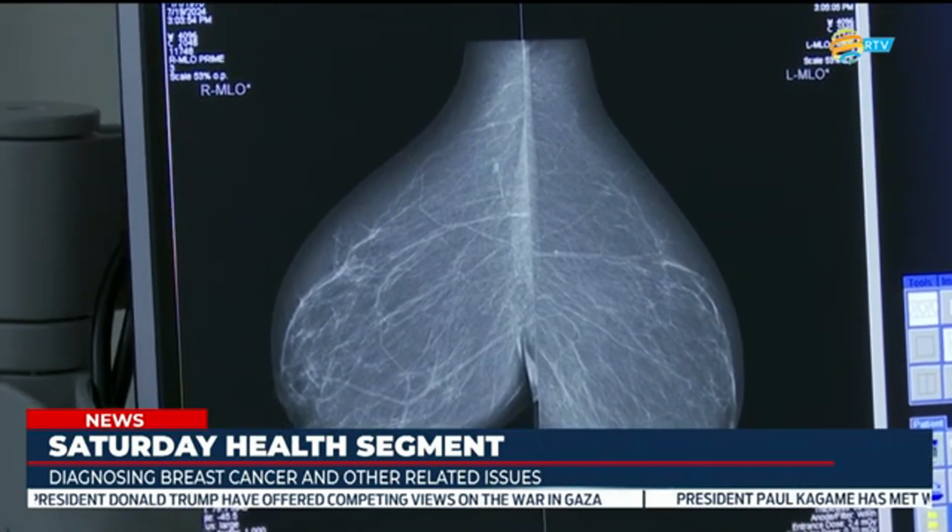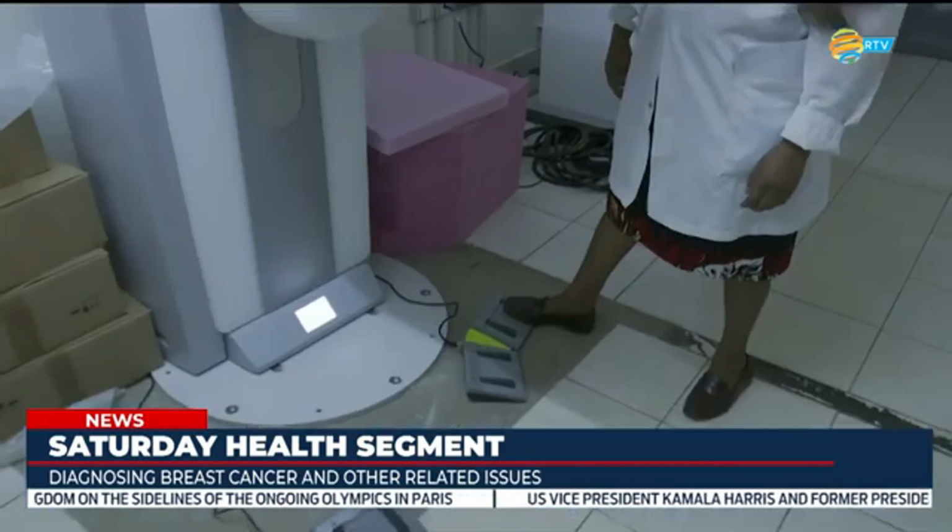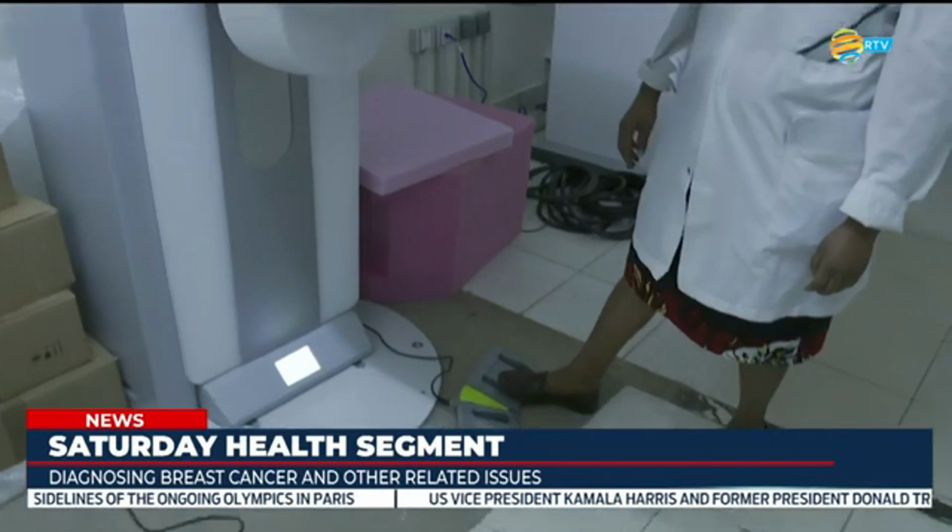In a normal routine, the time of the exam is almost 10 minutes. Within 10 minutes, the exam is done. Then if there is a decision for biopsy, within the next 1 hour the radiologist provides the report. If there is need of that biopsy, the next step will be to prepare the patient so that he can be aware of what is going to be done. So we schedule that biopsy for another day after communicating even with the treating doctor who sent the patient.